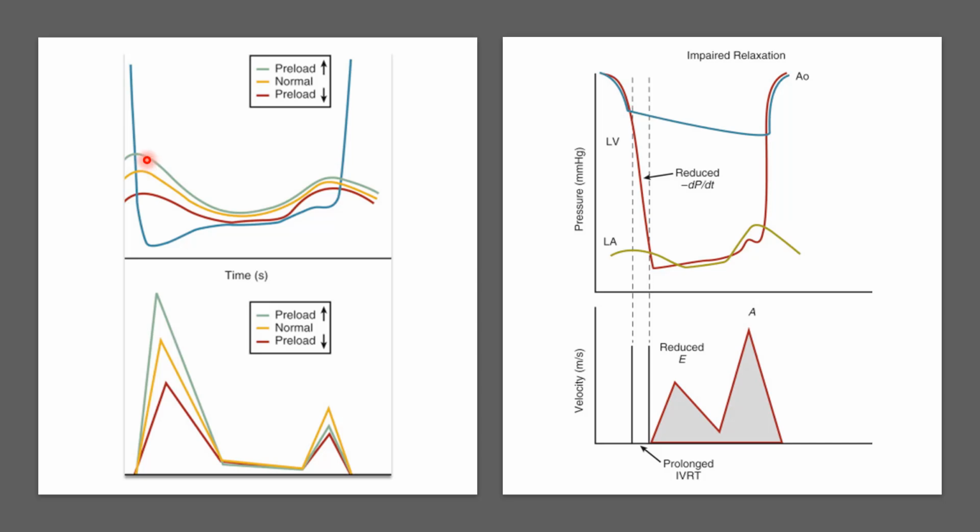I can bring them down. I can diurese. I can bring them down to down here as well. And so in someone with cardiogenic pulmonary edema, you can see this difference over time. If you have someone who's on dialysis and you UF them 4 liters and they were up here before, if you repeat that test, you'll probably see that they'll come down to here.